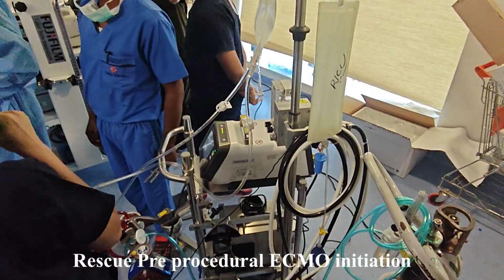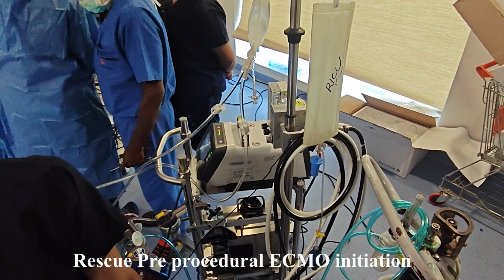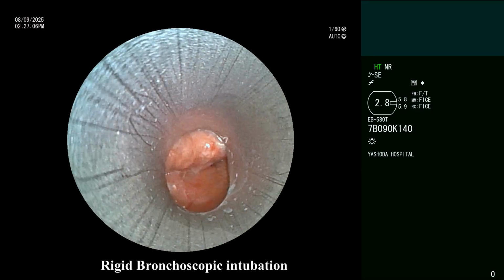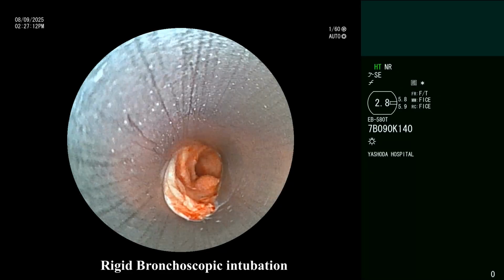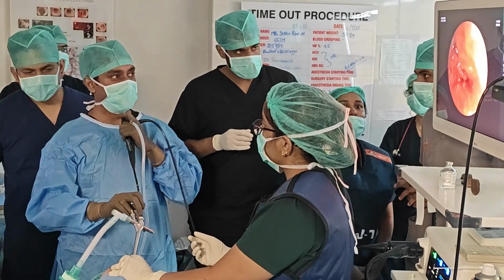So this was a case of a VV ECMO which was initiated as a bridge to the stenting, and once the patient is stabilized with the ECMO, rigid bronchoscopic intubation is done safely. This ECMO helps us to avoid the desaturation as well as lack of ventilation during the procedure.